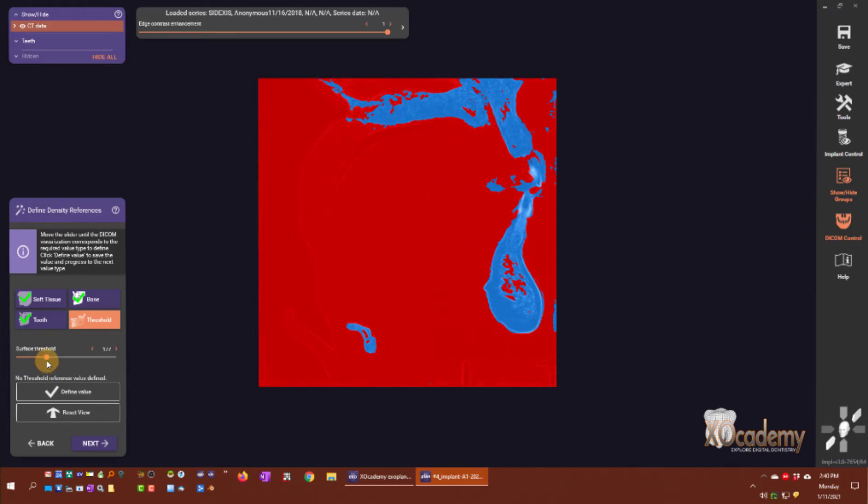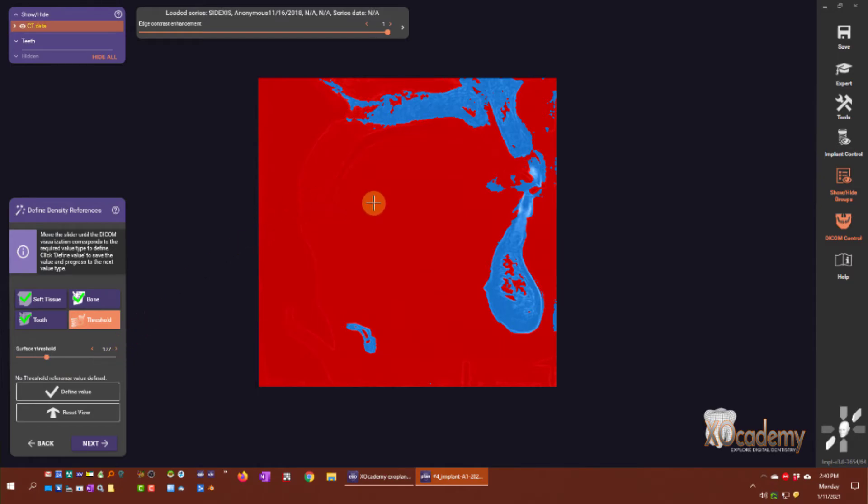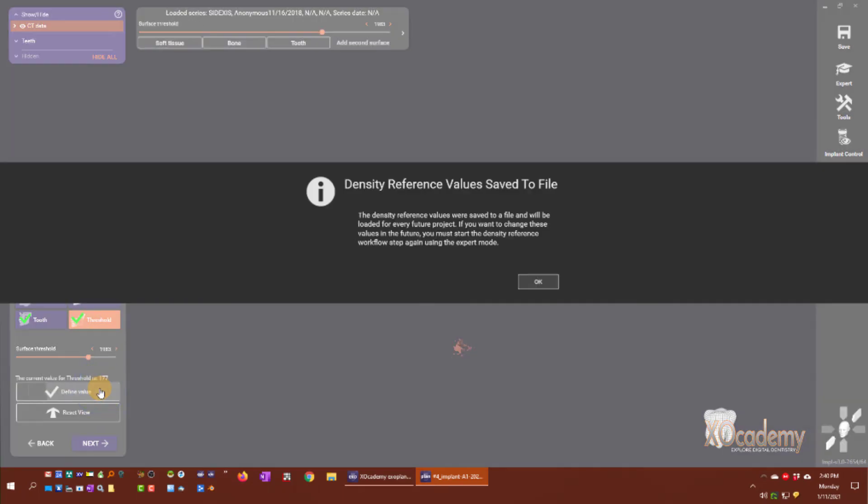This will define where the outer extent of the cortical plate is. This is going to define where the implant is in and out of bone. I'm going to click define value there.